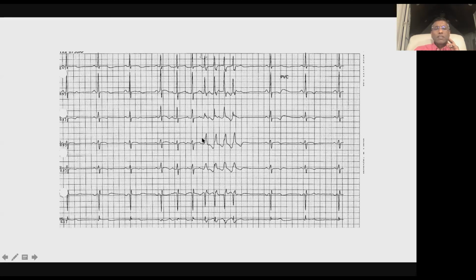So now come and look to the left of what's going on here. You have P wave, P wave, P wave. And then is this one narrow or wide? This one is narrow. These two are narrow. So why are these now faster? Look, this is the intrinsic sinus rate. What's going on over here?